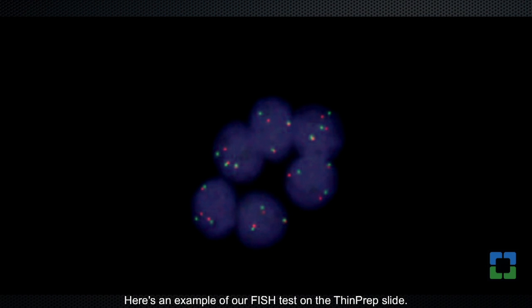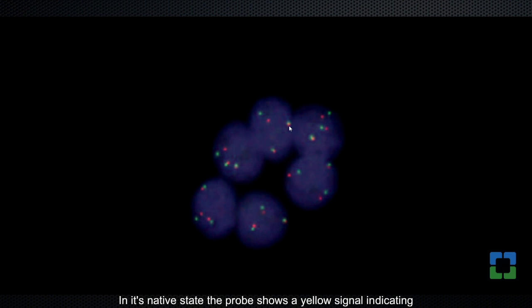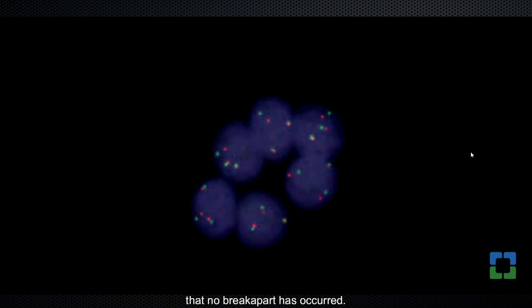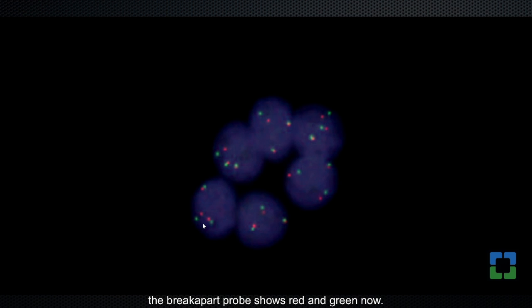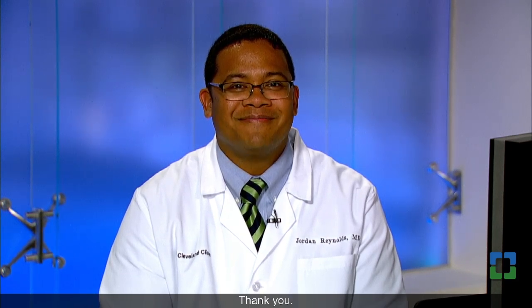Here's an example of our FISH test on the thin prep slide. In its native state, the probe would show a yellow signal indicating that no break apart has occurred. However, in cases where there is a mutation, the break apart probe shows red and green. This patient was able to receive the crizotinib therapy, and they are doing well today. Thank you.